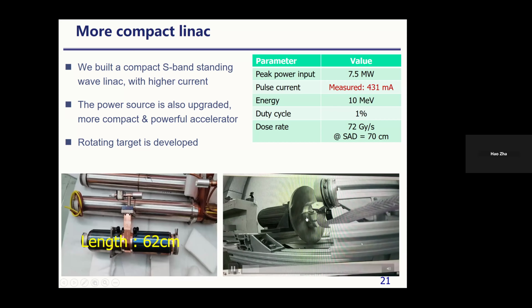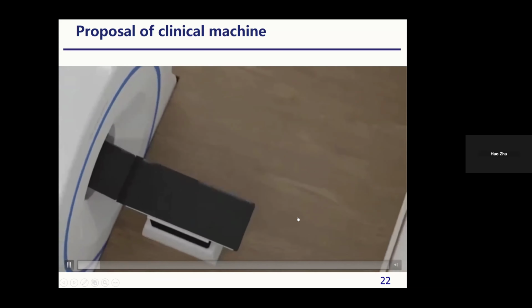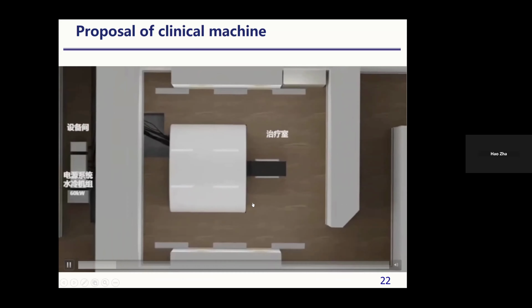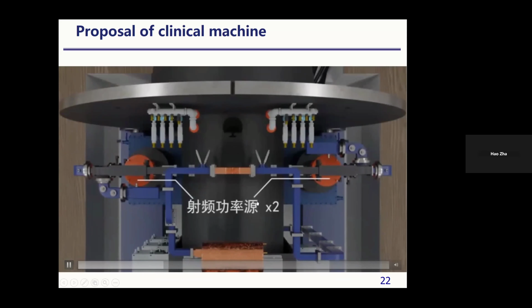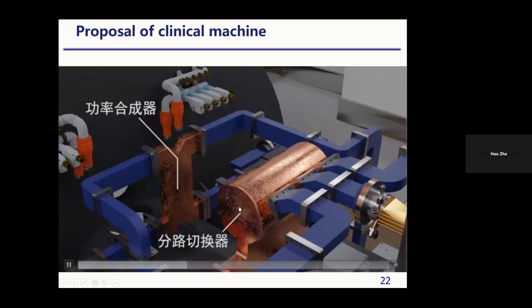So with this foundation, we began developing a clinical prototype machine. This is an animation. As you can see, our system can be installed in a conventional hospital Linac bunker.